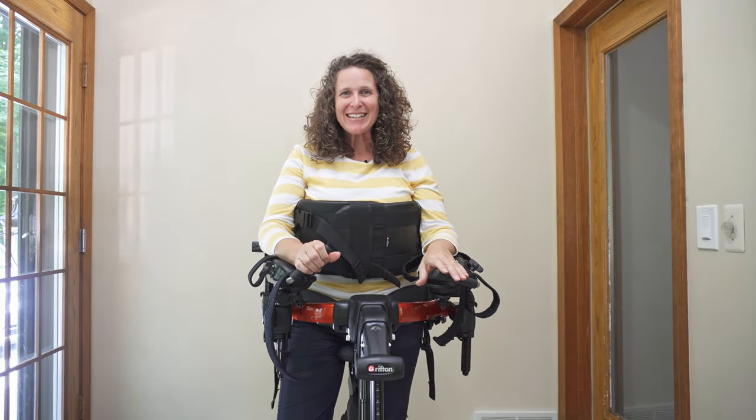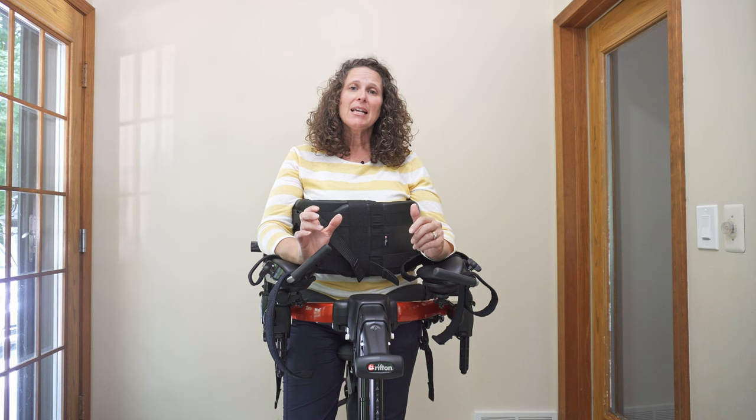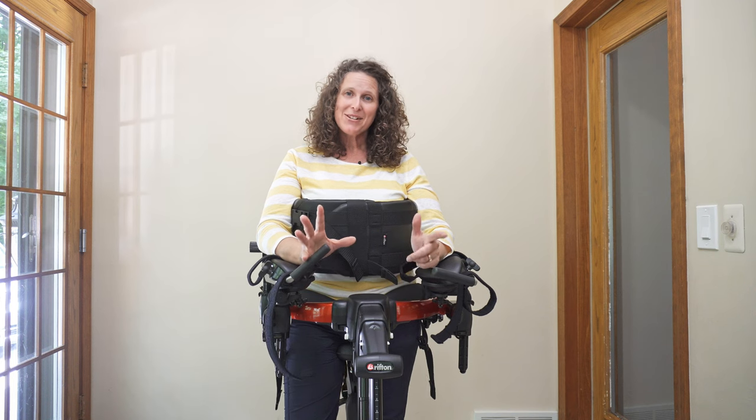Hello, my name is Kathy Ripmaster. I'm a physical therapist, and today I want to talk to you in depth about the Rifton Pacer, and specifically with a person who presents with a significant kyphosis.